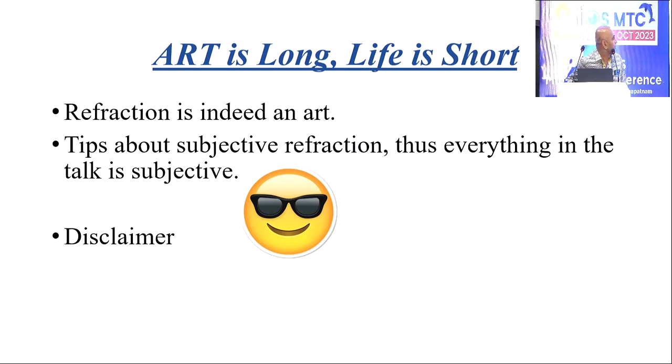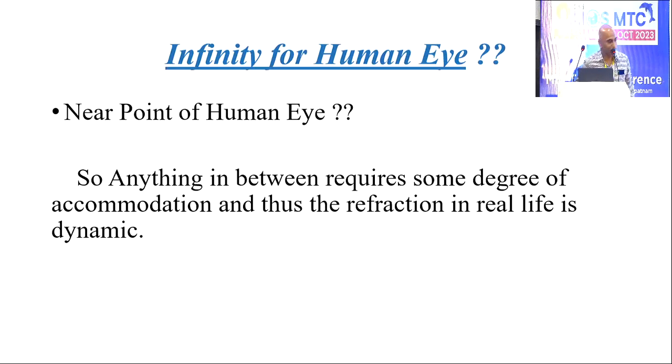Art is long and life is short, and refraction is indeed an art. As this topic is about subjective refraction and the way I do it, it could be subjective. That's a disclaimer. So, what is infinity for the human eye?